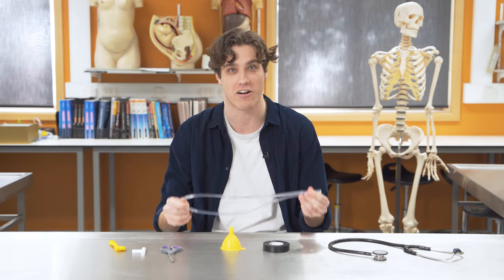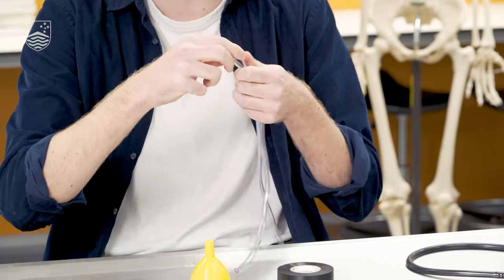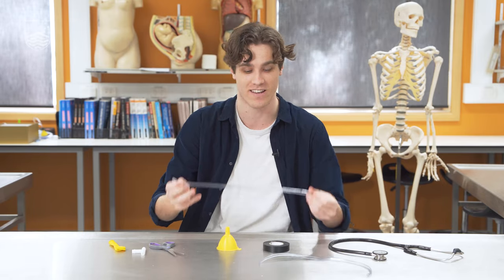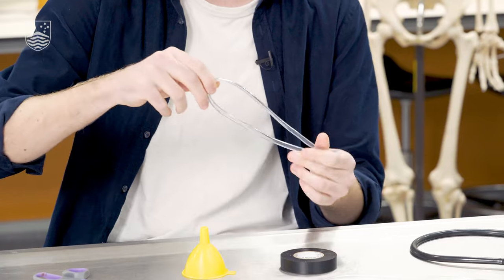To start, we're going to take our clear vinyl tubing and fold it in half and then cut directly down the center. We're going to repeat this step again with one of the halves so we're going to make two smaller pieces.